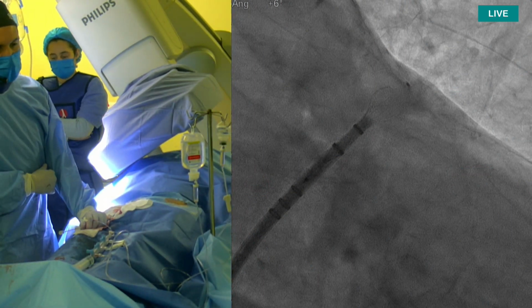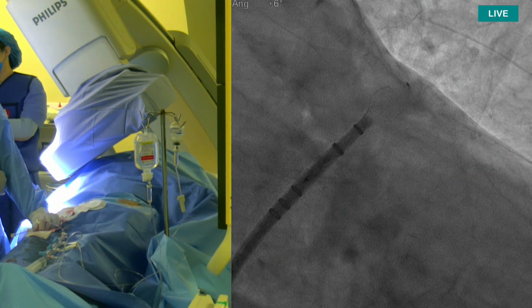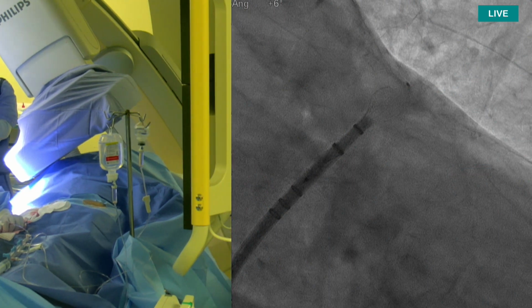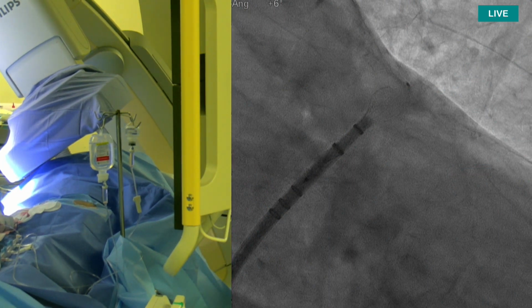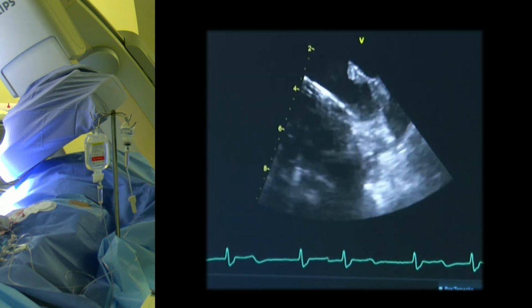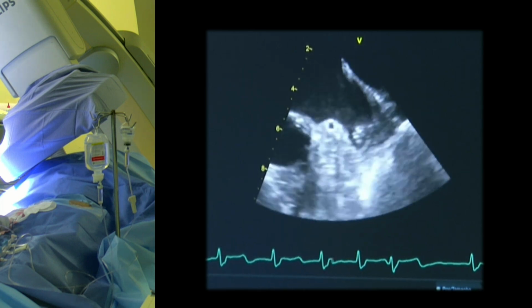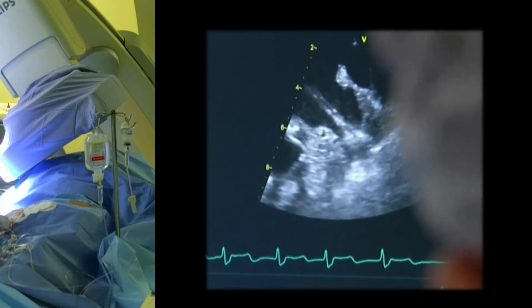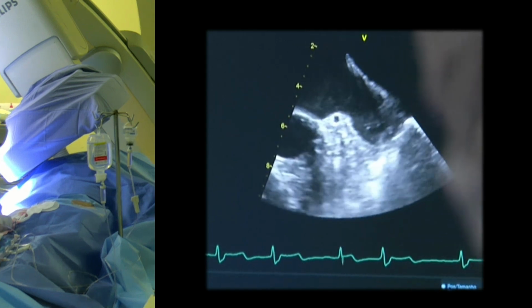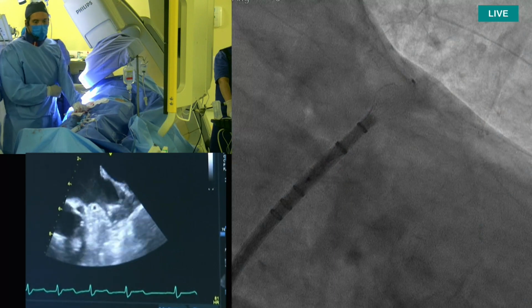We will just use that small lobe in the distal end to keep the nice coaxiality, but of course the device will not have to come to sit, or we will avoid that it sits in that small lobe, yes? But so that's why we said also that we will more unsheath than push out. Just maybe while we push out 2-3 millimeter the device, we will 4-5 millimeters pull back on the delivery. That's how I would do it, like 1/3 push, 2/3 pull back, and then we can do it controlled and slow. Okay. Yeah, that's good.